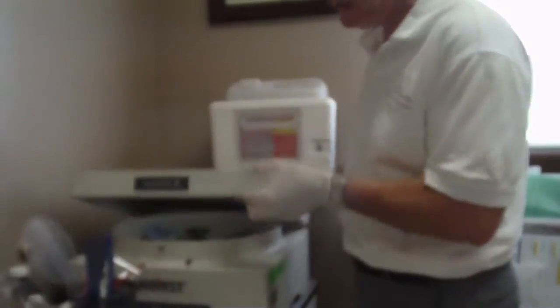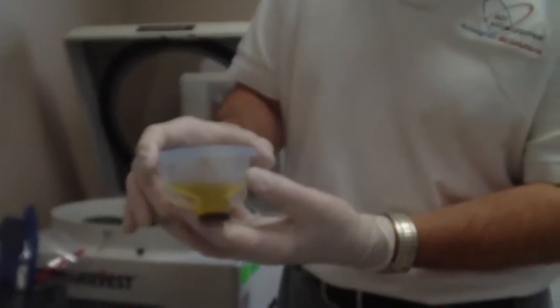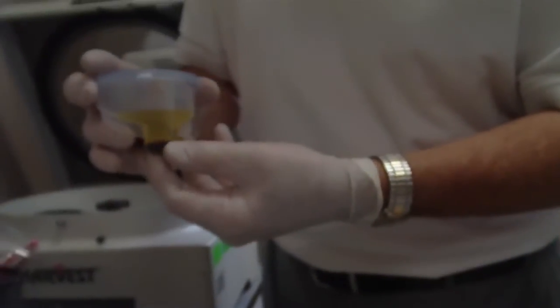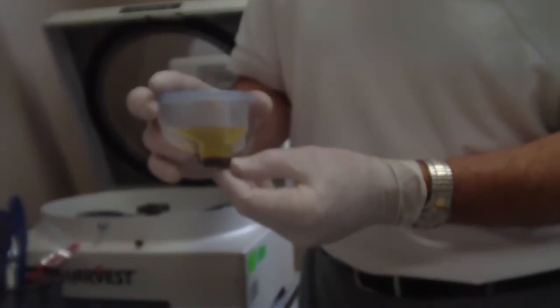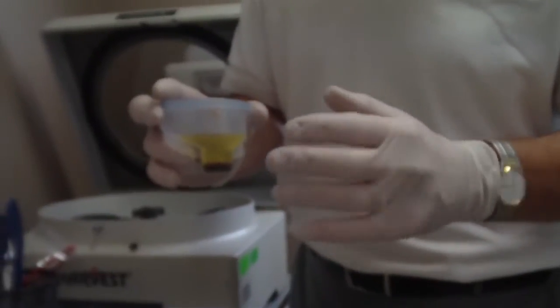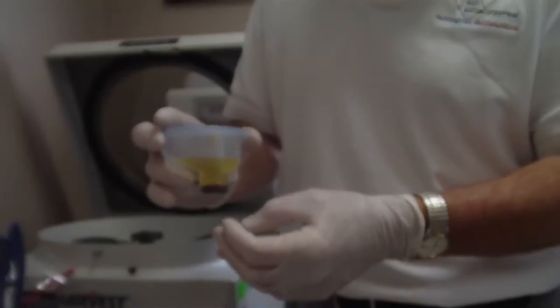We've finished spinning our 14 minutes. What was once red is now separated into its components. We've got yellow for the plasma, and red for the red cells. The red cells back here are probably pretty close to being dead — they're very light and the same weight as these platelets. To get the really strongest platelets, you almost have to dip into that red cell layer to get the really robust ones. That's the technology behind why you've got a little bit of red in there.